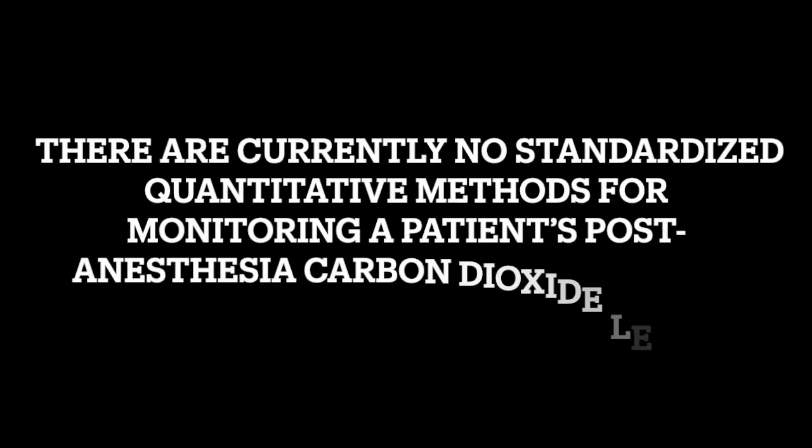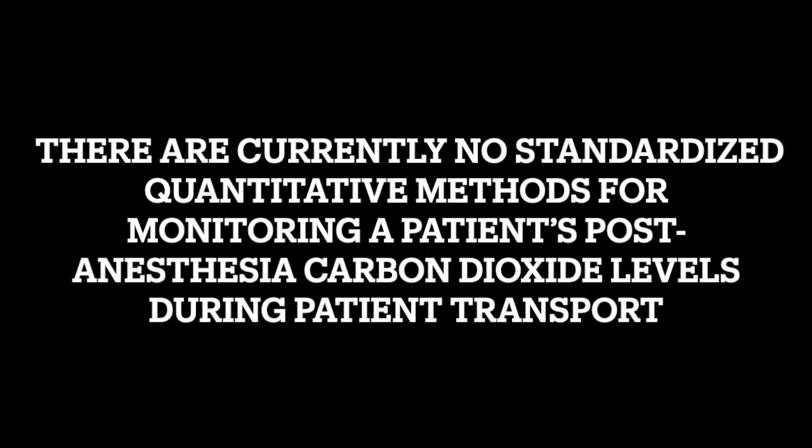Dr. Chap. There are currently no standardized quantitative methods for monitoring a patient's post-anesthesia carbon dioxide levels during patient transport, leaving hospital staff reliant on subjective assessments that carry significant risk of complications.